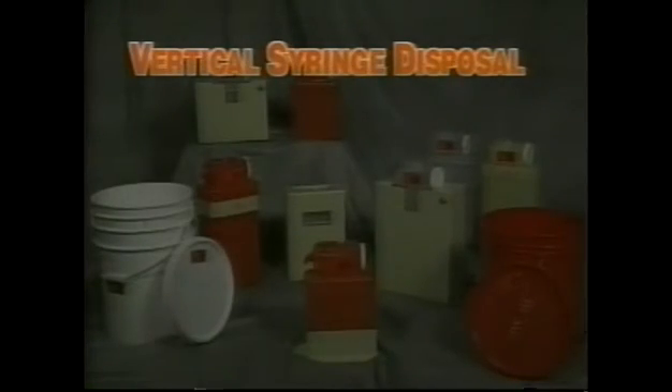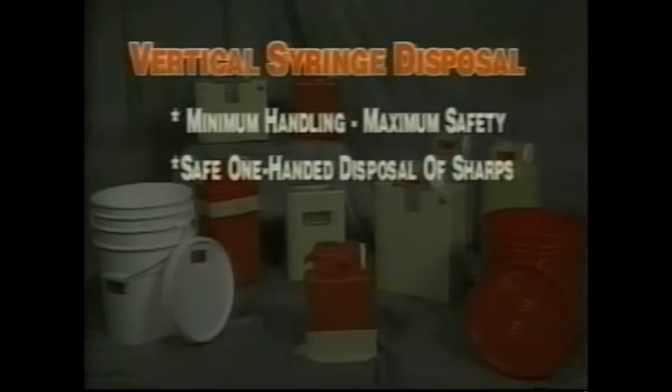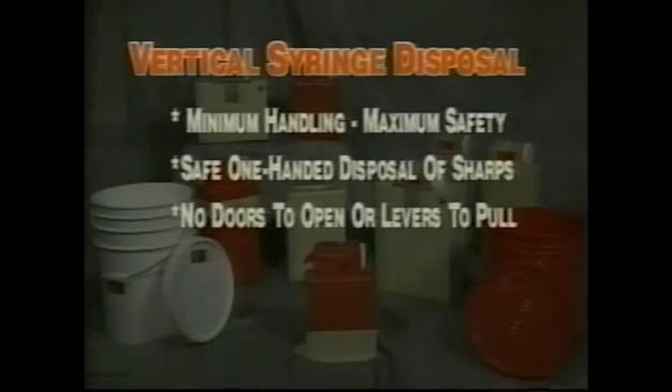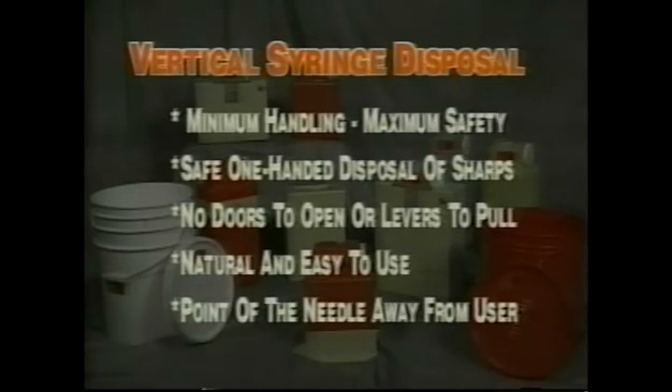Our units utilize vertical syringe disposal, the safest method for sharps disposal. All safety engineers agree: minimum handling maximizes safety. This vertical drop system allows safe one-hand disposal of sharps — there are no doors to open or levers to pull. The vertical drop is natural and easy for personnel to use, and the point of the needle is always away from the user. For more information, please contact your local distributor.